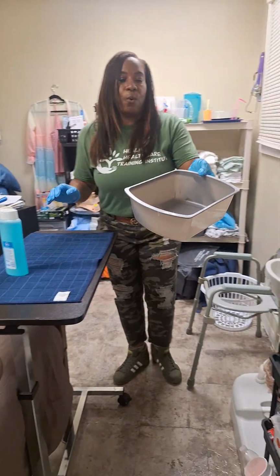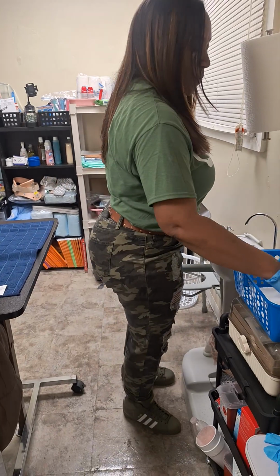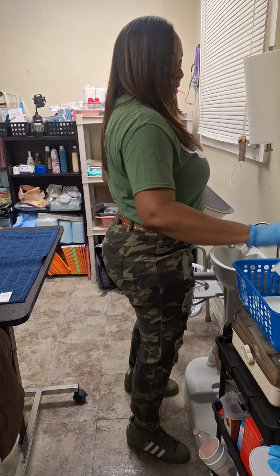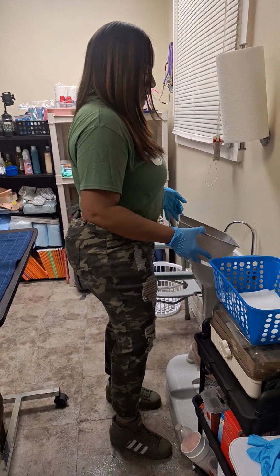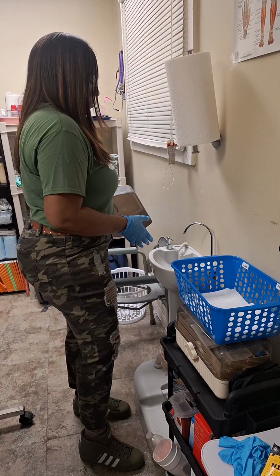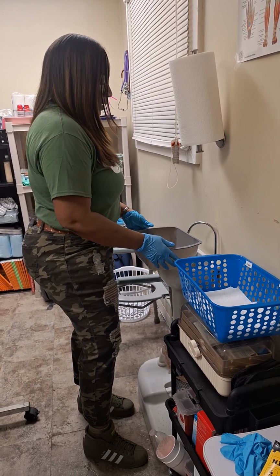So I'm going to grab my water. I'm going to pour it in the sink. I'm going to grab a paper towel, turn on the water, throw that into the garbage, rinse out my basin 3 times. Once, twice, 3 times. I'm going to sit it on the counter.